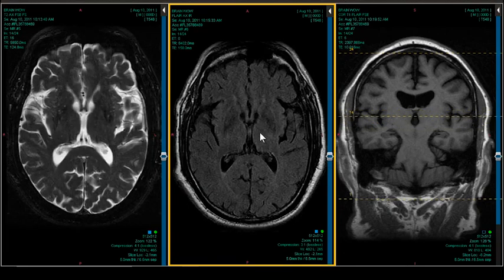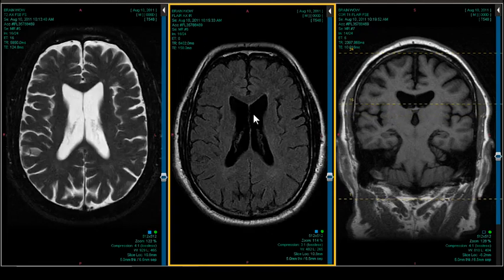And you don't really get that paramagnetic phenomenon of excessive low signal. The only excessive high signal you're going to see is as the disease progresses in a very atrophic putamen, which this patient has, with subtle high signal in the putamen. I think the key is the history and the massive dilatation of the frontal horns.